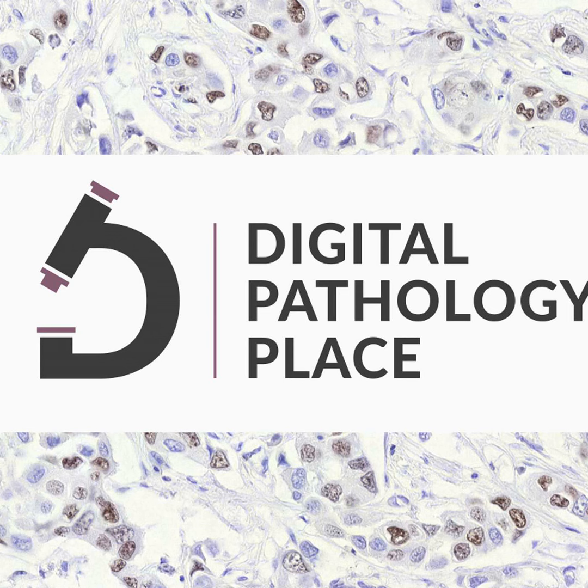The handcrafted feature approach. Before we had deep learning, for example, for IHC detection, you would define the size of the object, the threshold of the DAB, of the brown stain, and basically you would manually say, okay, most of my data looks like this. This is going to be applied. But you will always have data that are out of scope, as they call it.